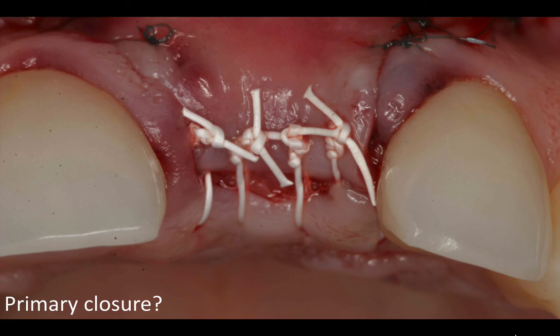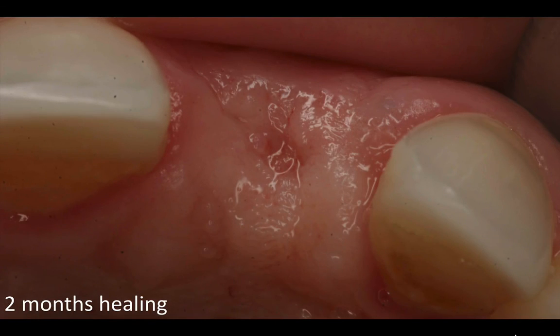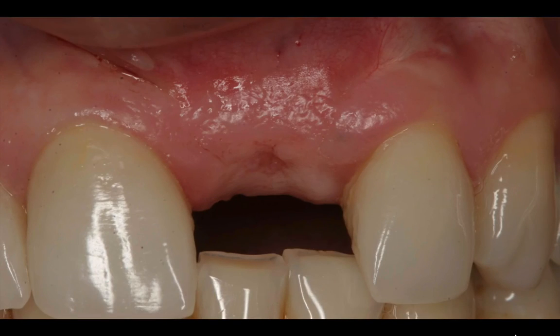I actually recommend secondary intention healing for extractions, leaving the occlusal part of the socket exposed with an X suture, for a few reasons. Number one, you'll get better tissue quality, more attached and keratinized tissue. Number two, as the socket heals, and it obviously healed very, very well if you're looking at it 2 months later, as it heals, look at the mucogingival junction.